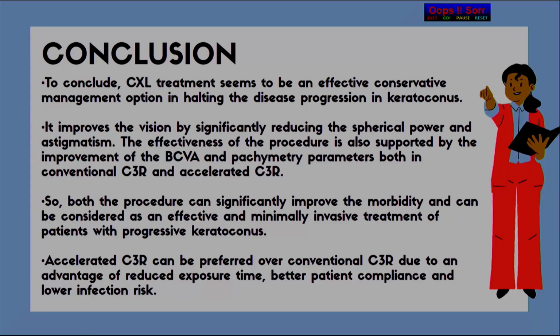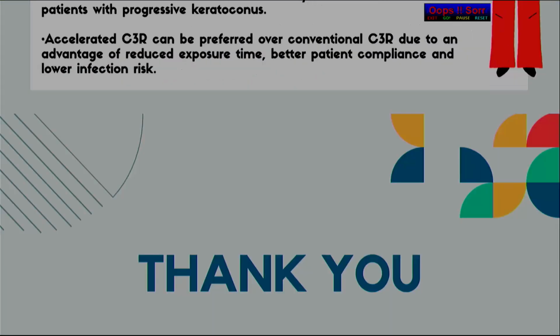But definitely patients will prefer the accelerated C3R procedure because it takes less time, gives better patient compliance and reduced exposure time, and there is also a lower infection risk because of the reduced time of performing the surgeries. Thank you.